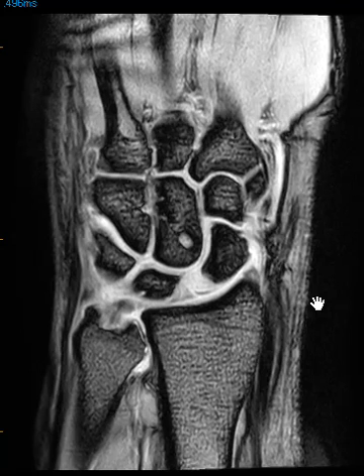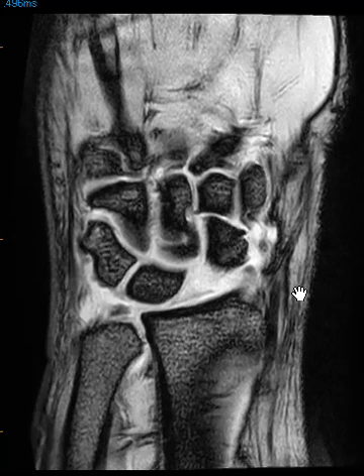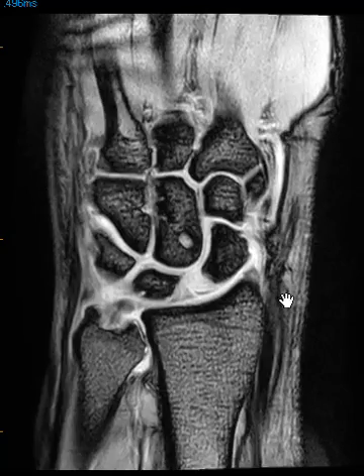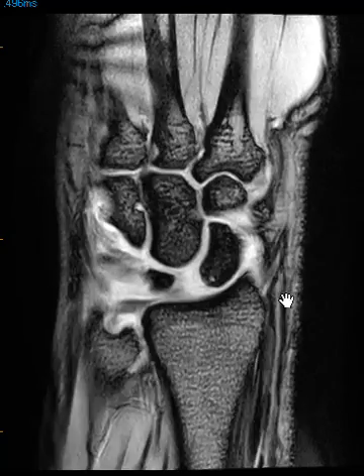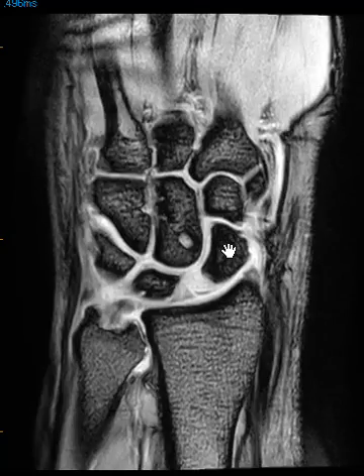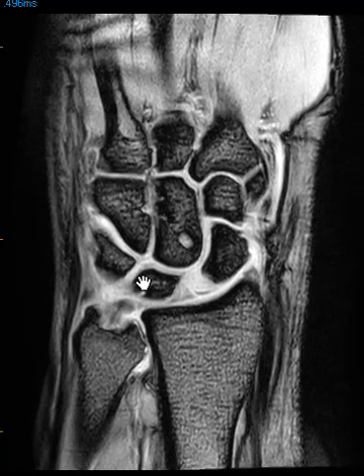Hello, this is Dr. Gay from First Look MRI. This is a 38-year-old male who fell about a month ago and has had continued pain. This is a wrist MRI, and we see here on this gradient echo sequence that the scaphoid bone is over here. This is the lunate bone, and there's wide separation between these two bones.